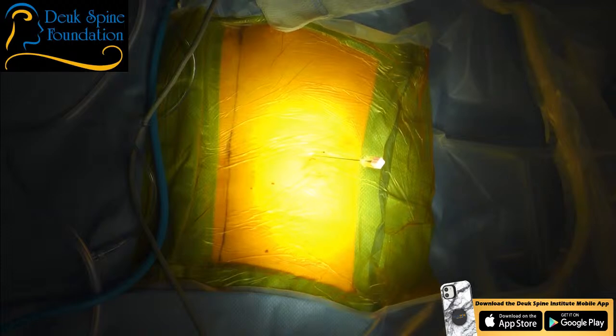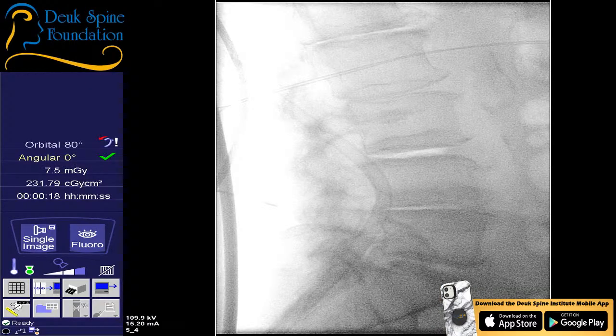So just like you have to navigate safely your ship around islands and rocks and reefs, I don't know, it kind of looks... I want to say worse, but let's keep going and see if we can get any better than that. And in effect, what we're navigating in surgery is our instruments. The L5 looks pretty good, but the S1 doesn't look right. I think you're in the right direction, though, maybe. Go a little further. Let's see if you can bring it together.